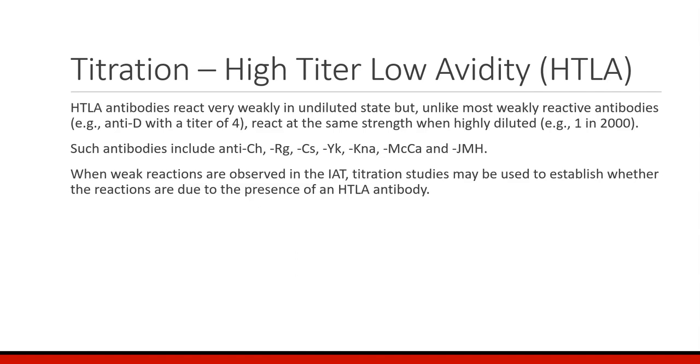There's a whole bunch of them, but low avidity, because apparently the reaction is very, very fluid, and they're coming off and coming on at the same time. To remember, there's avidity and affinity. There's affinity, but there's not much avidity. They're not able to stick on. Such antibodies include Chido, Rogers, the rest of them. I don't want you to memorize the specificities, but I do want you to recognize or say what HTLA is, define them, and state how helpful a titration is in working these up.